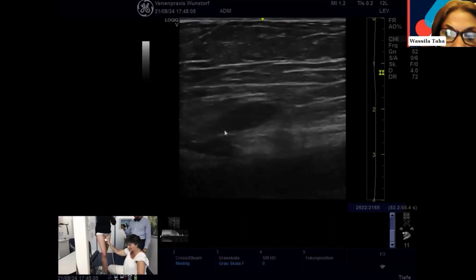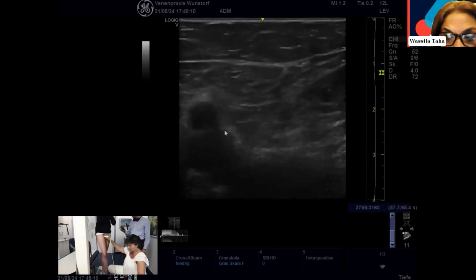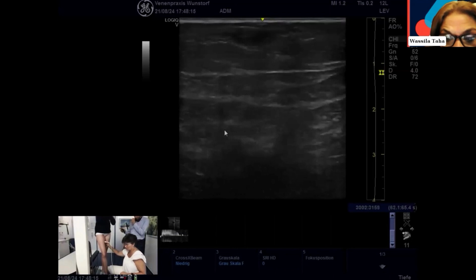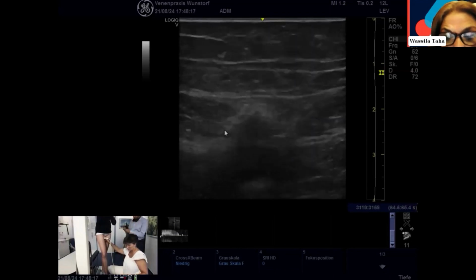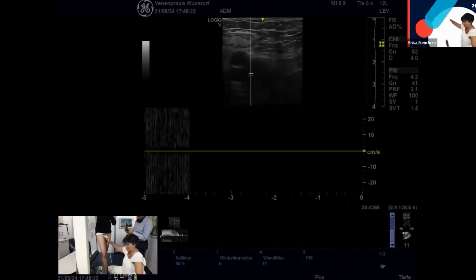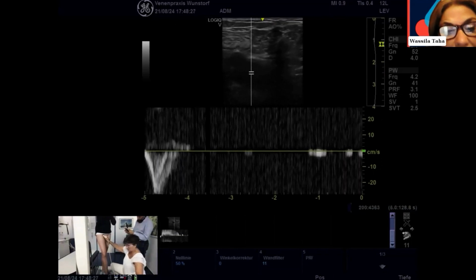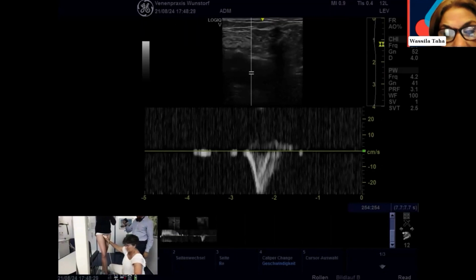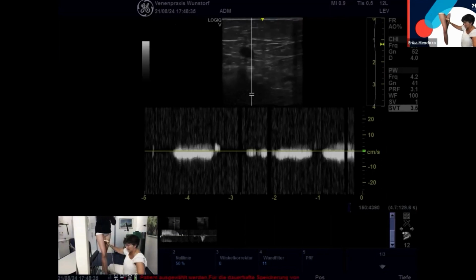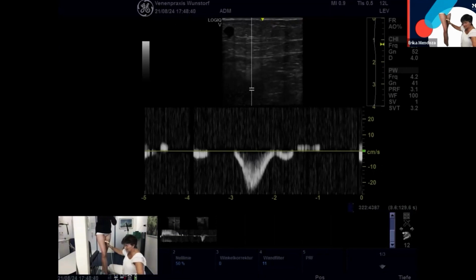With Erika, we have some points about the deep system from Peter Samak, that this lady may have deep vein reflux. And from Erwin, is everybody seeing scar tissue in the deep venous system? Could you scan the deep system, please, Erika? The femoral vein at this level, if there is any reflux, or even by B mode, if you can see any synechia from previous DVT. This is competent. This is a healthy femoral vein.